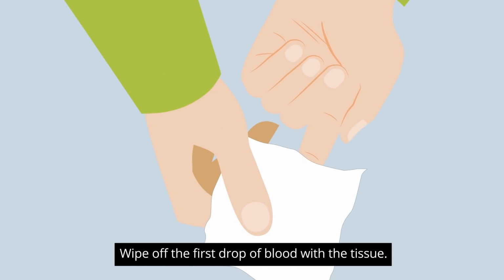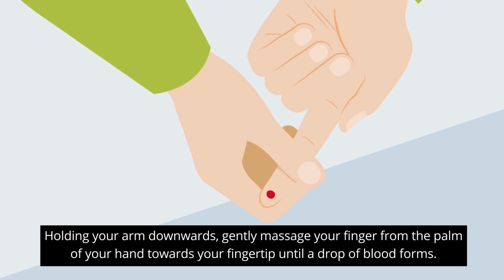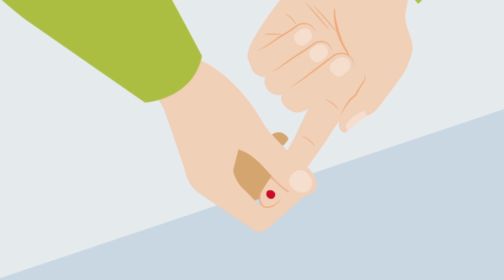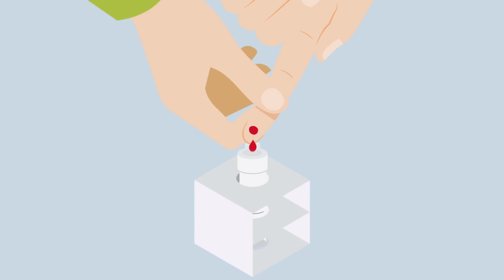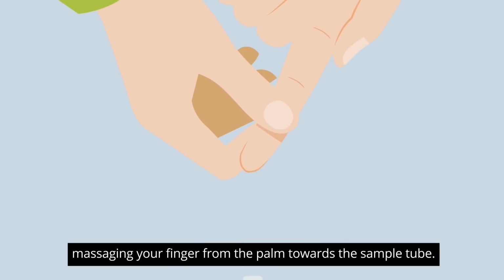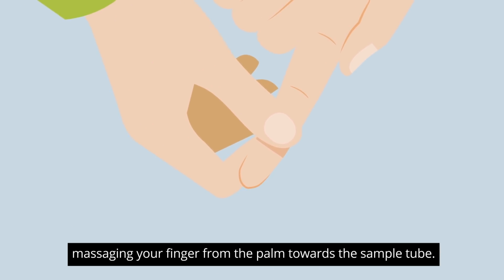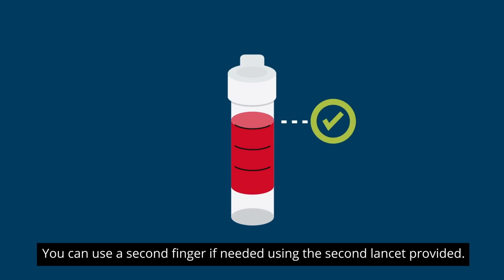Wipe off the first drop of blood with a tissue. Holding your arm downwards, gently massage your finger from the palm of your hand towards your fingertip until a drop of blood forms. Use the lip of the edge of the tube to guide the droplets of blood in. If the blood flow slows, wipe with a tissue and continue to hold your arm down, massaging your finger from the palm towards the sample tube. Fill the sample test tube to the top line. You can use a second finger if needed, using the second lancet provided.